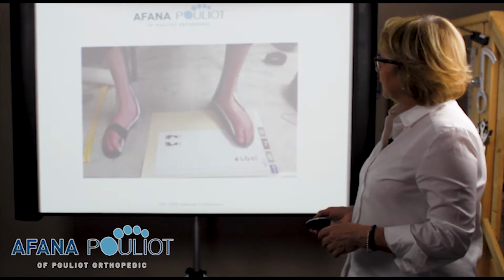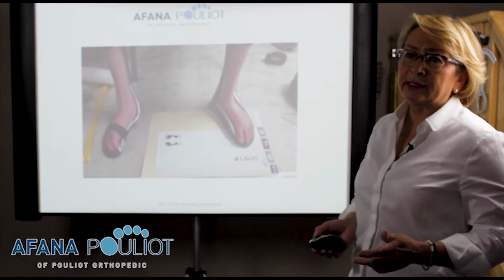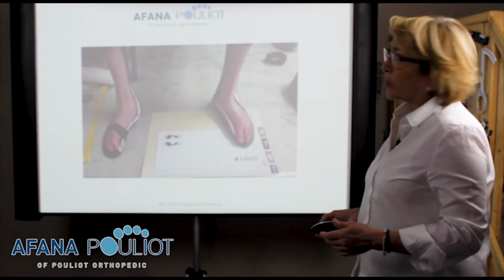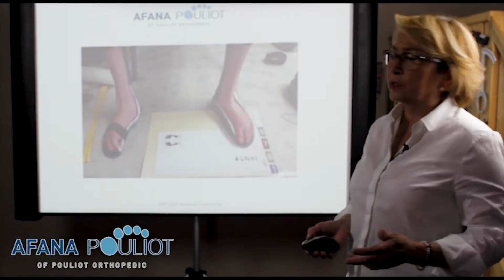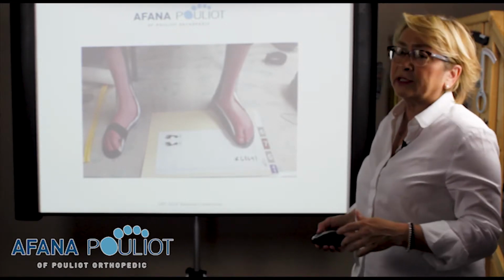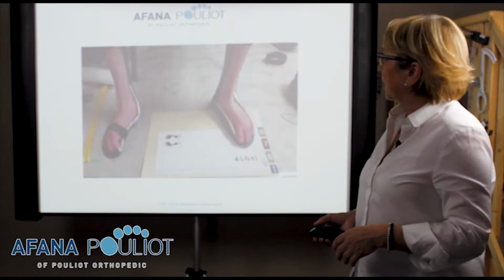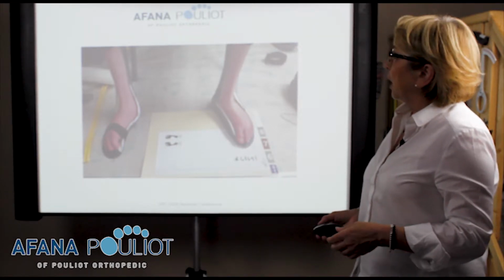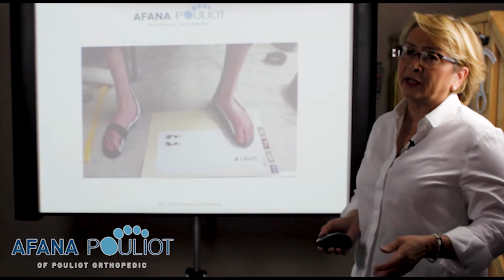A patient that is wearing AFO on both legs. As you might imagine, this patient is not walking much. There are transfers that he can do. So the main purpose of the footwear was to protect his feet from being hurt. So as mentioned in our video, we do take the molding with the AFO on.